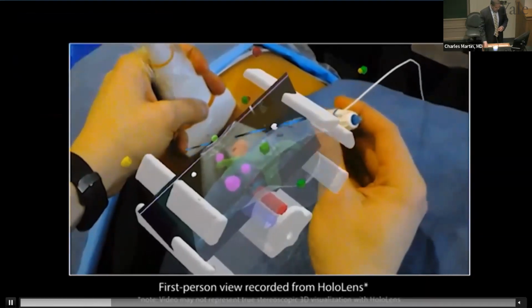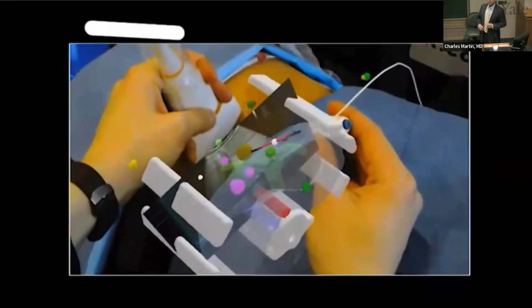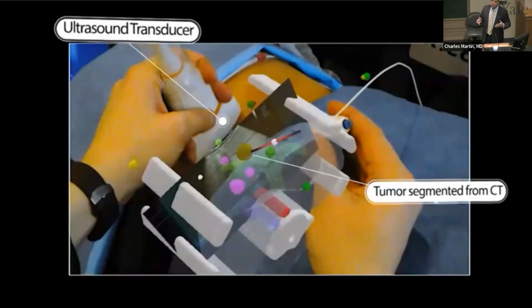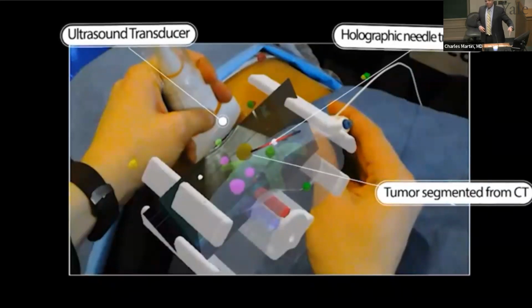And you can see it moving here the whole time. The other thing is that we've also superimposed an ultrasound image. We call it flashlight mode, but we can either put the ultrasound image directly coming down, which our trainees sometimes like, because then they're able to see the plane at which the ultrasound is projecting, so they can figure out where to traverse the needle. Or alternatively, it'll just focus in our headset right there.